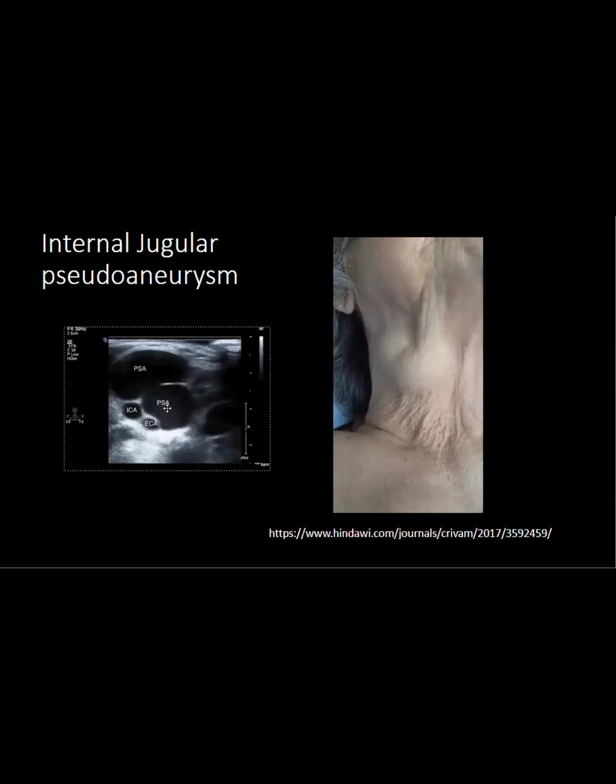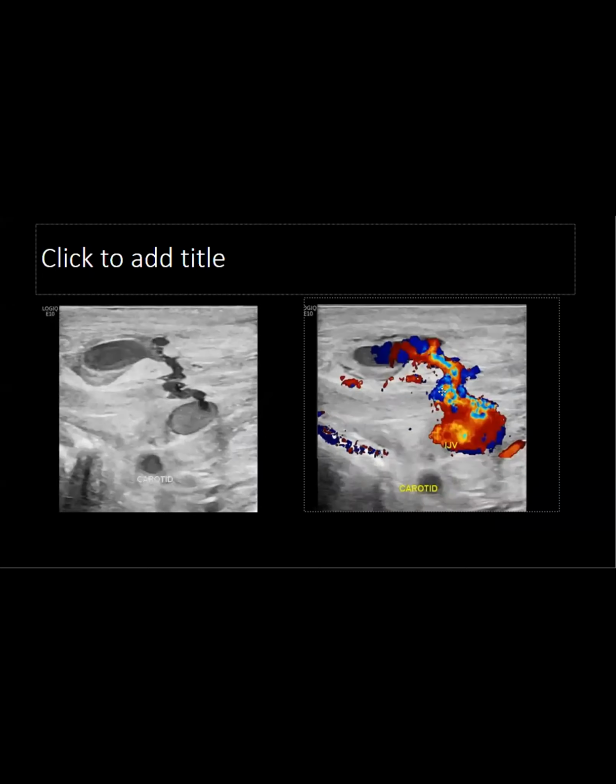And so I would talk to my IR colleague, like, would you do anything about this? And he said, basically venous leaks usually tamponade themselves off. Because they don't have high pressure flow, usually the surrounding tissues will tamponade it off. And as long as there's good inflow and outflow, the jugular vein itself will not thrombose. So as long as all the sinuses from the brain are still draining properly, hopefully this part will thrombose itself off and the jugular will stay open. They don't usually have to intervene on venous bleeds.